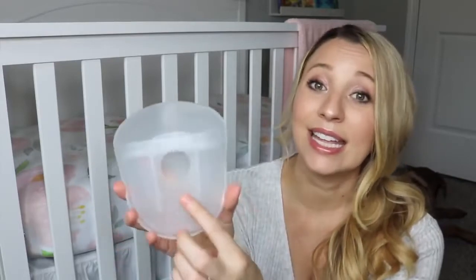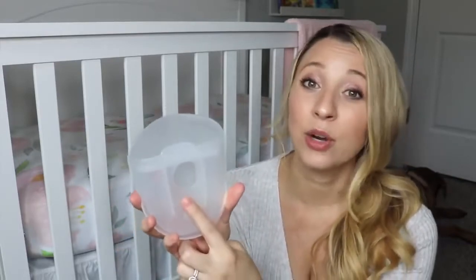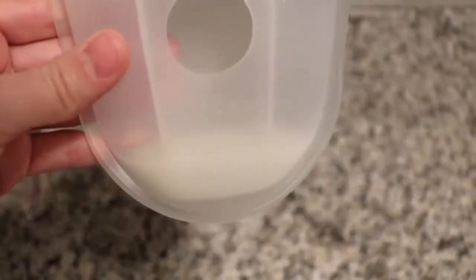The product that I use while I'm nursing is this Milkies Milk Saver. This goes on the opposite breast from the one that I'm nursing on. It's not a pump — it just collects any leakage that you have that would otherwise go into a nursing pad.